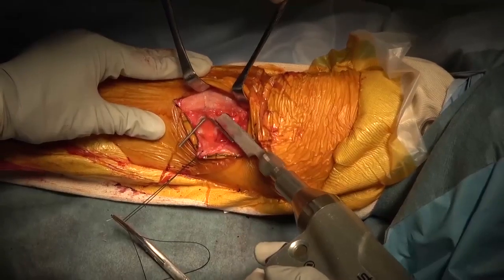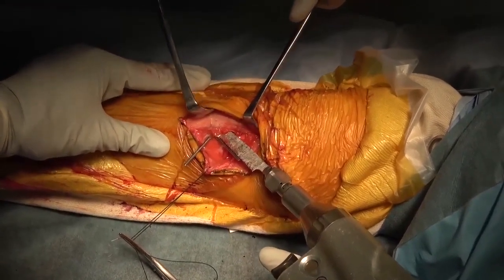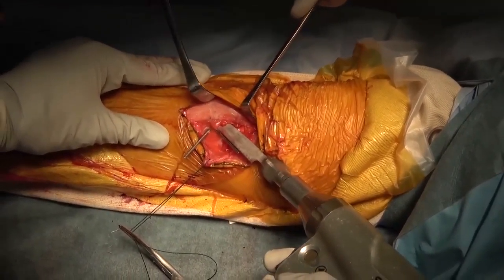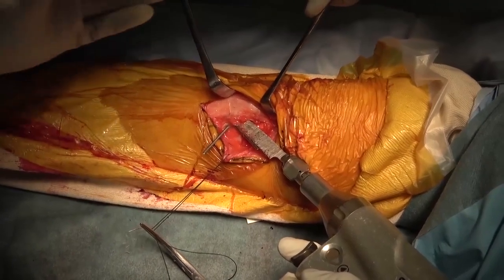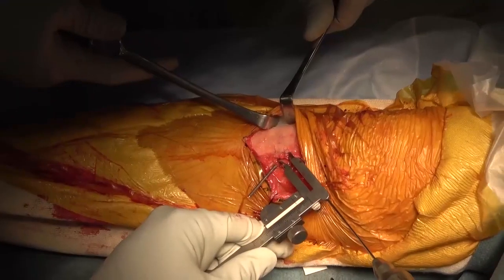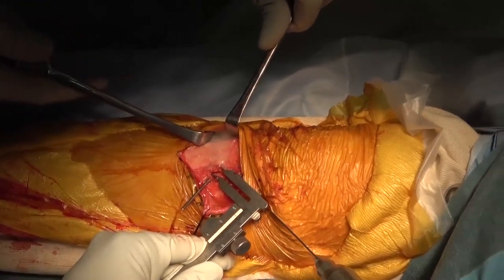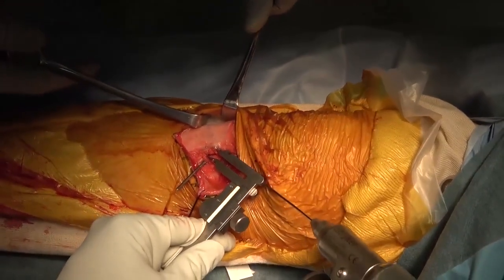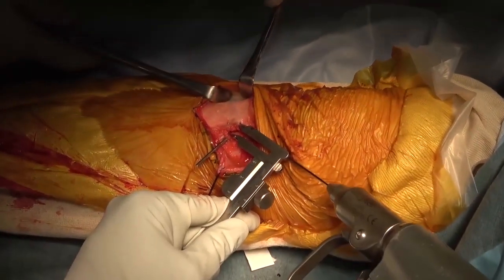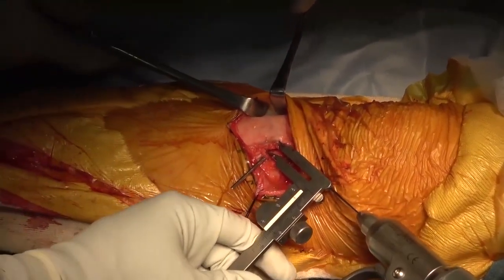After removing the second guide wire, with the blade of a reciprocating saw oriented distally, the descending osteotomy is completed to reach the fourth guide wire. Another 1.5 mm K-wire, parallel to the fourth wire, is inserted to be tilted 45 degrees proximally from the descending plane as a reference for an oblique ascending osteotomy.